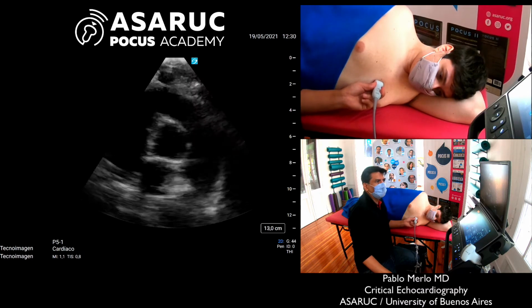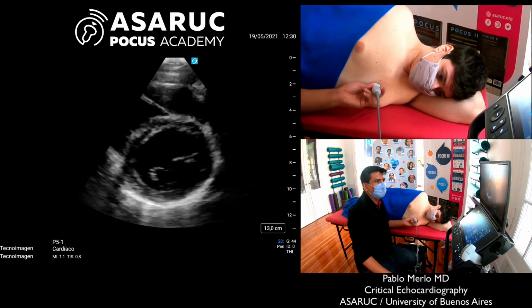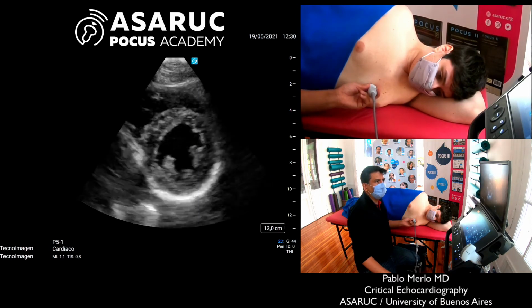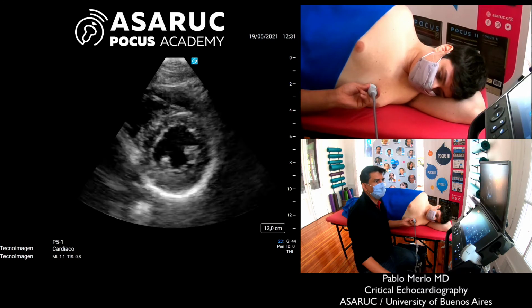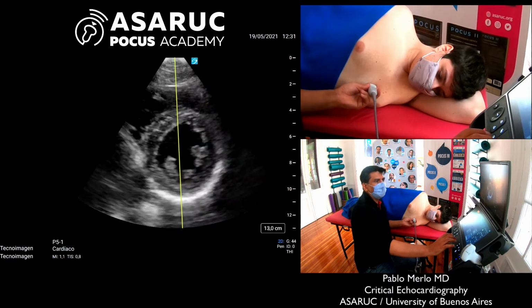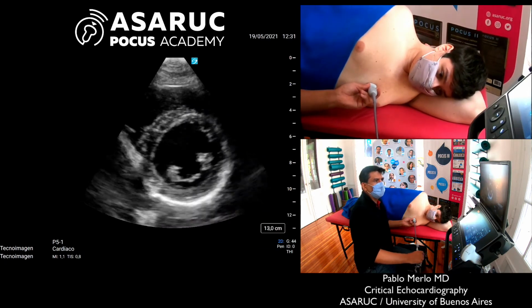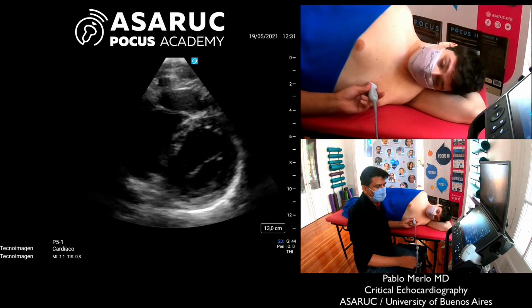Let's go back to the short axis view of the great vessels. We lower the transducer cable from the previous mid-ventricular short axis view, which is the one we see now, with the papillary muscles. A mid-ventricular short axis that enables us to see the position of the interventricular septum, as well as assess the left ventricular systolic function and whether there are segmental motility disorders. Here, with M mode, we can also see the left ventricle diameter and thickness values.